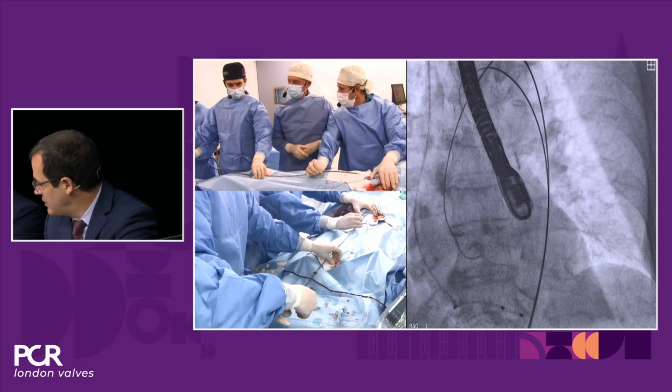But any thoughts from the rest of the panel about the case introduced and getting set up to start moving? Yeah, I think it's a very good approach for a highly comorbid patient. What you could also take into consideration, because for TE you need general anesthesia, I've heard from Japan, I have no experience myself, but you could also use ICE for positioning. And what we do in our institution, we also use just wires for landmarking the aortic root. So these could be some alternative approaches, but I think the way you introduced it is very compelling.